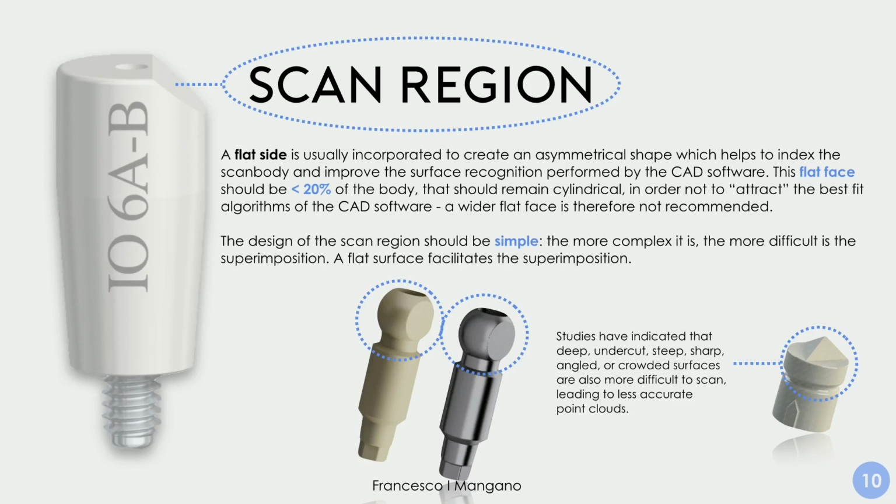I mean, technically it should be less than 20% of the whole surface of the cylinder, because otherwise there's a risk of distortion.